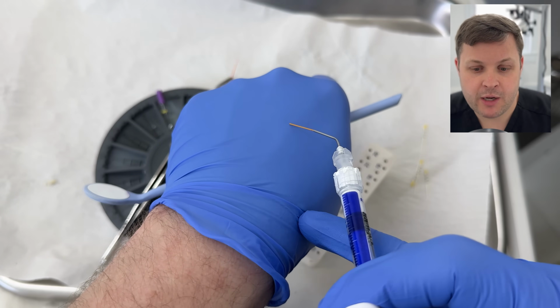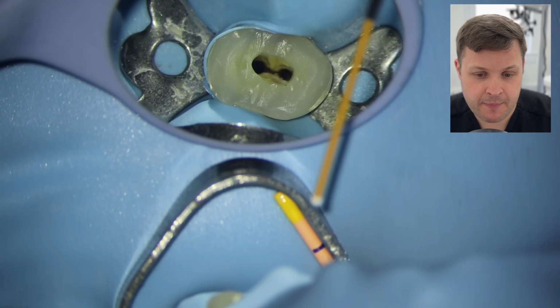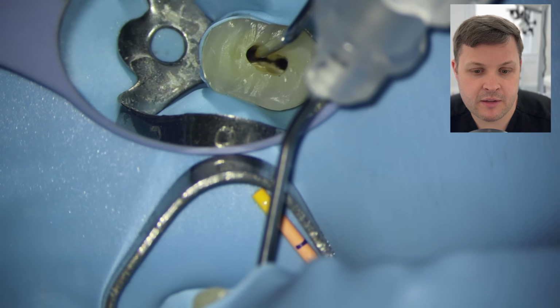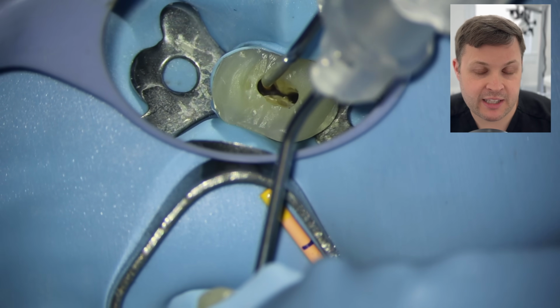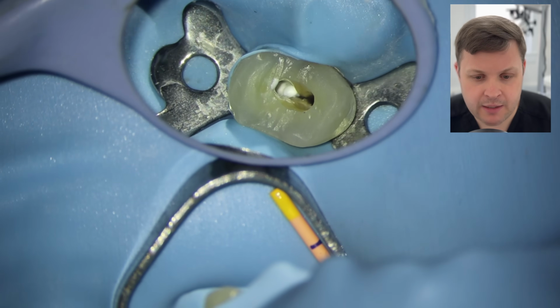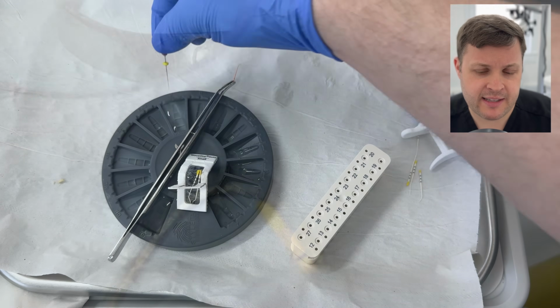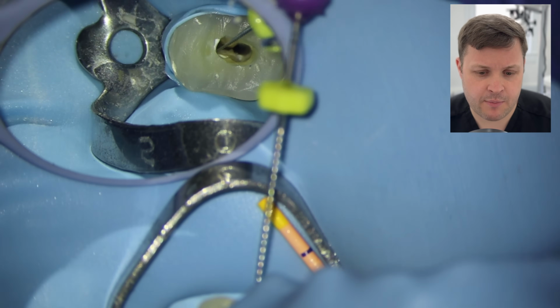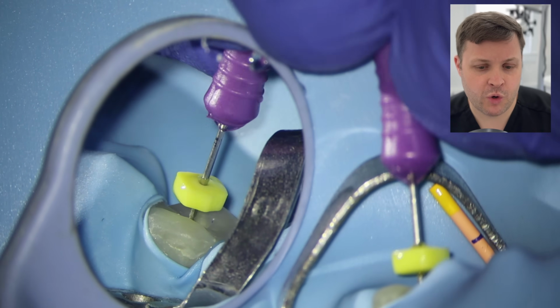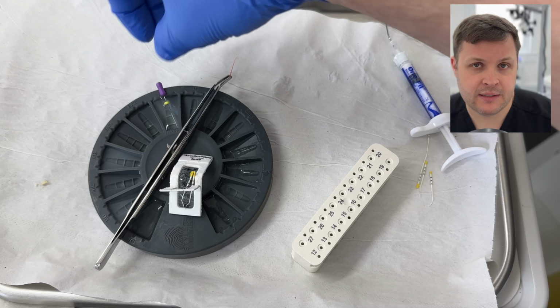And then we're going to pick up our bioceramic. I'm using these Visco tips here. And then I am going to fill the buccal canal. So we're going to directly inject bioceramic into the buccal canal. I then pick up our disinfected hand file, dry that off again in the same way, and I'm going to introduce this hand file to almost the working length, and this is going to introduce the bioceramic into the canal space.